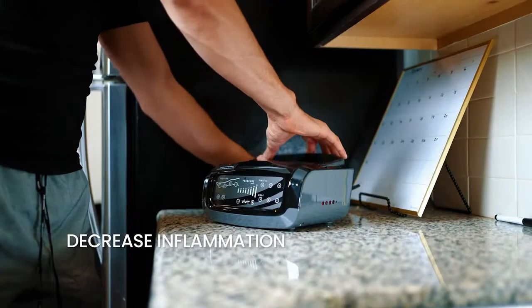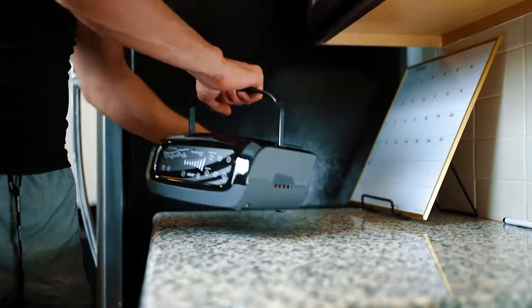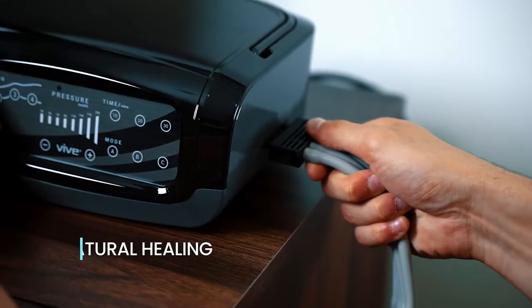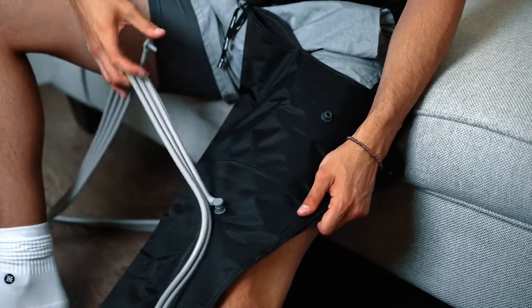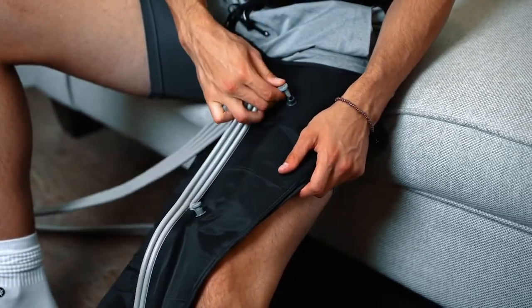The Vive Leg Compression System provides sequential compression therapy, improving circulation and blood flow to provide pain relief and promote natural healing. It's designed to reduce swelling and soothe leg pain and aching muscles, making it a rehabilitation essential.